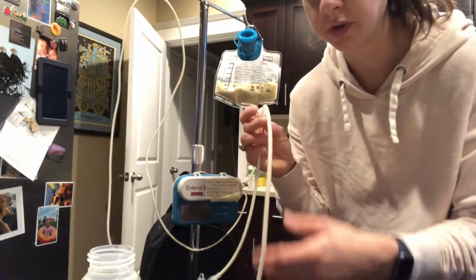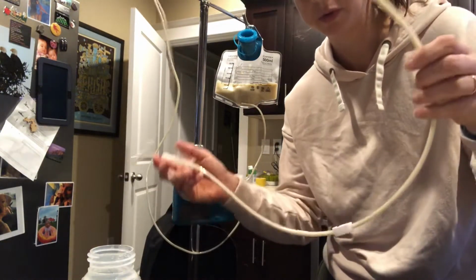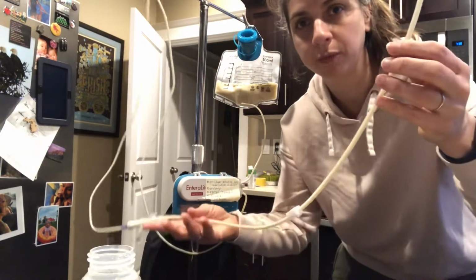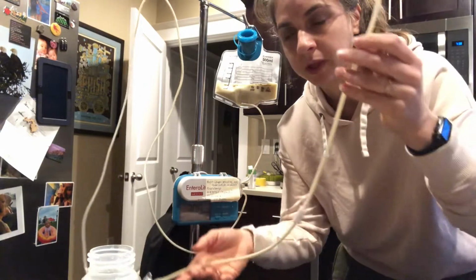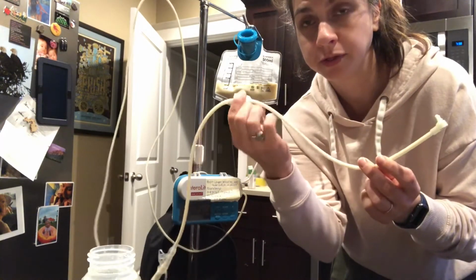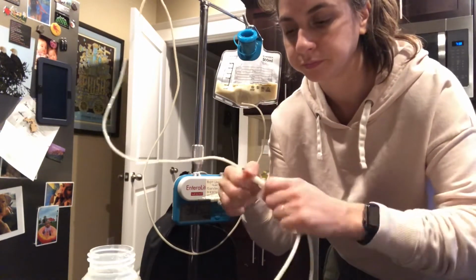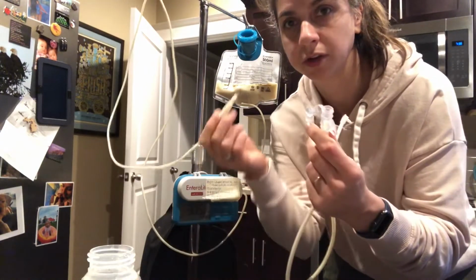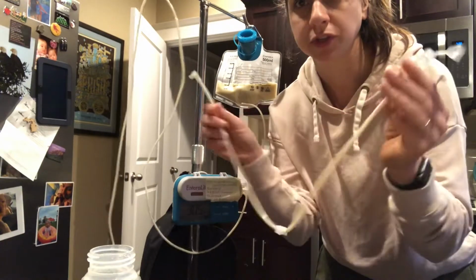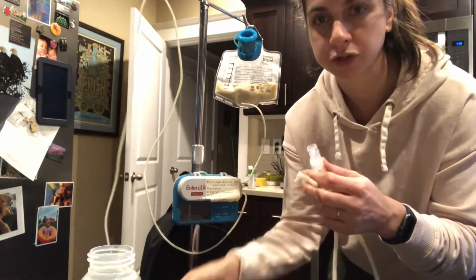There's two ways that you can hook her up. One is by having her on like a changing table close to this whole contraption and just hook her up with this already connected. The other thing that you can do, which is what we usually do, is we clamp the tube so that nothing will come out, and then we just unhook it from here so everything's primed, no air, and then we just hook this up to her, put her in her chair, and then hook this up, and I'll show you how to do that in just a second.